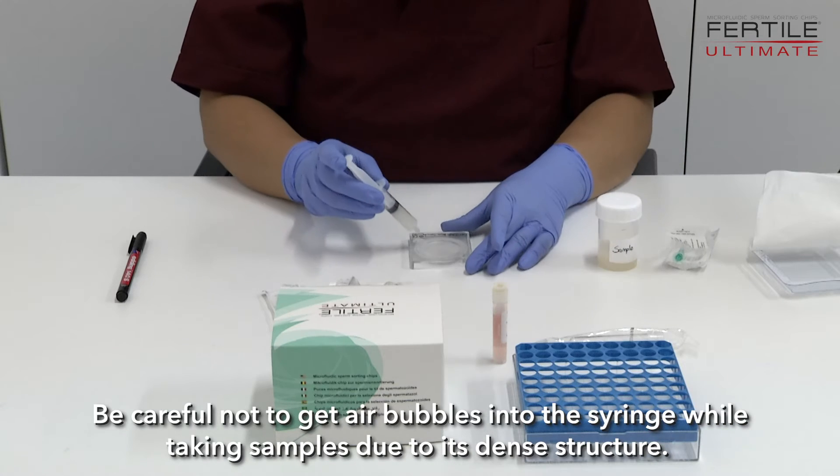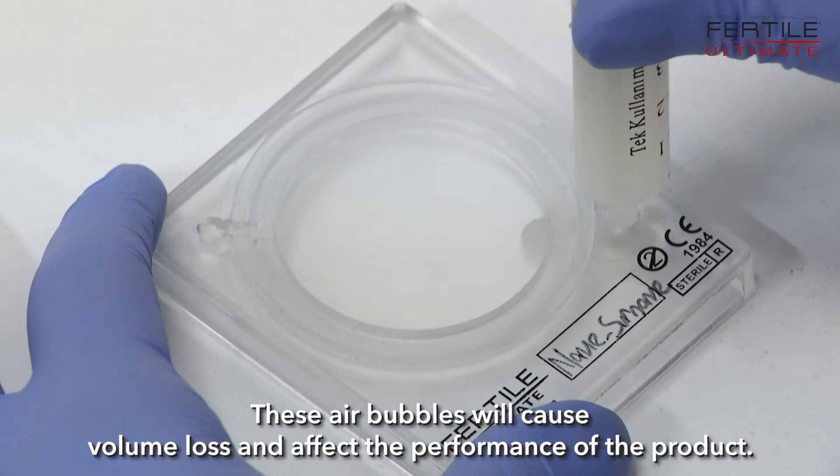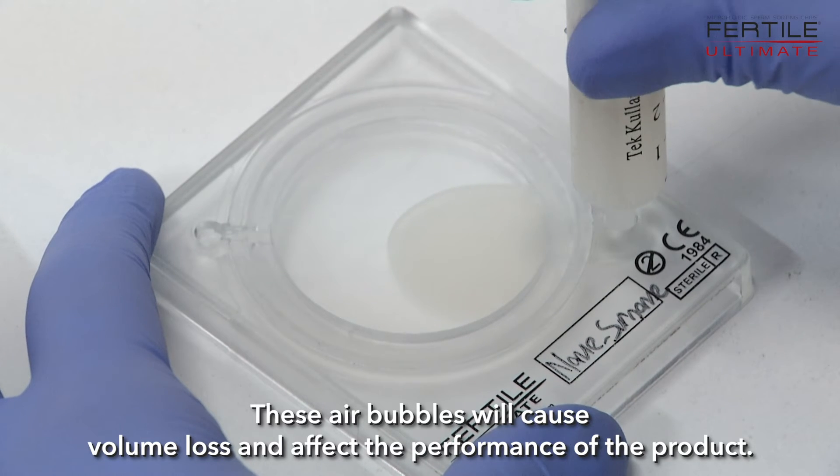Be careful not to get air bubbles into the syringe while taking samples due to its dense structure. These air bubbles will cause volume loss and affect the performance of the product.